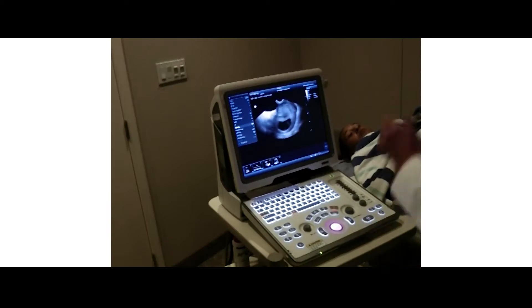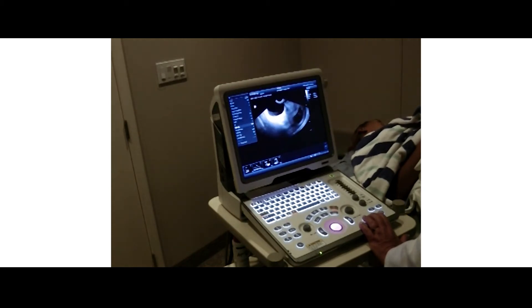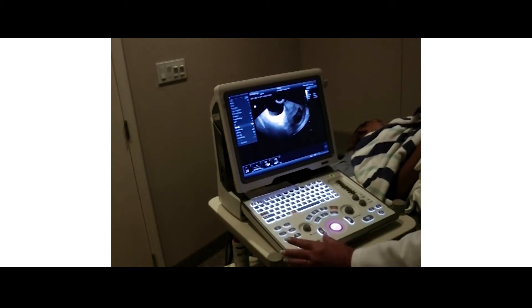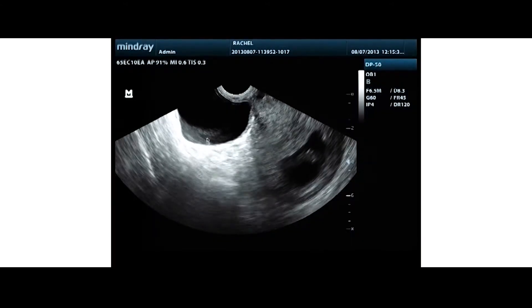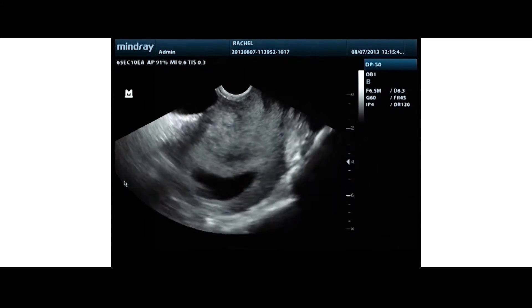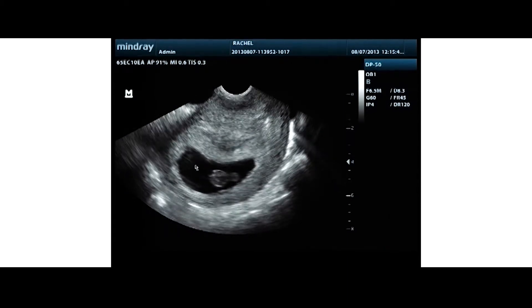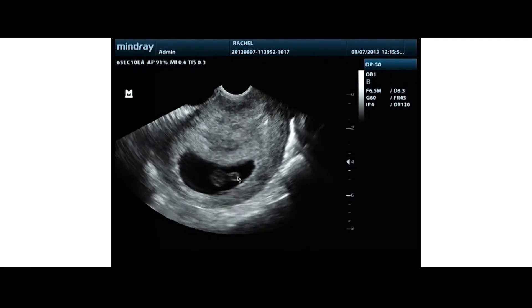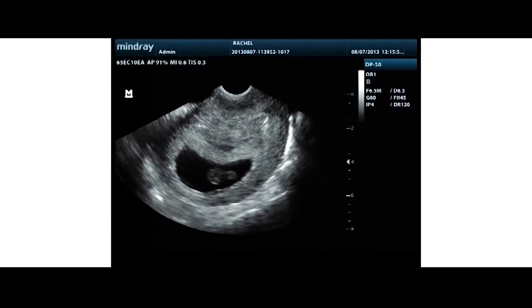We have Rachel and we just started to do a transvaginal ultrasound on her eight-week baby. She didn't empty her bladder completely, but we're going to go ahead and deal with it. Sometimes when the bladder isn't empty completely you get artifacts that interfere with the image. We've gone in and we have the transvaginal ultrasound with the uterus, gestational sac, here's the baby, and here's the yolk sac.